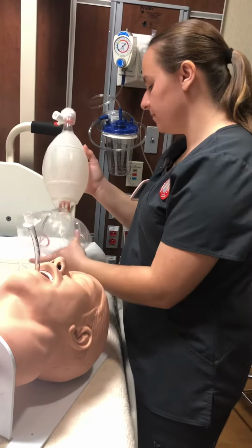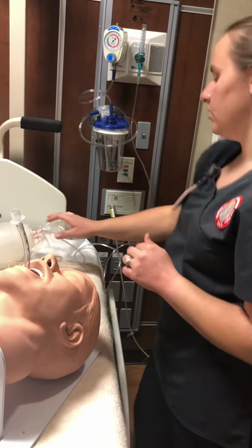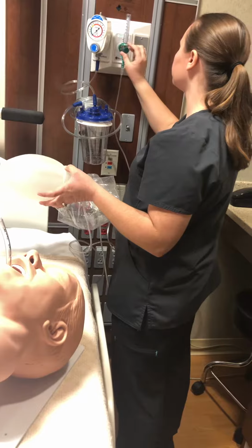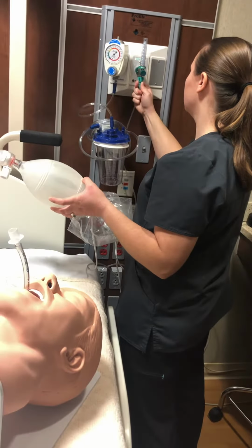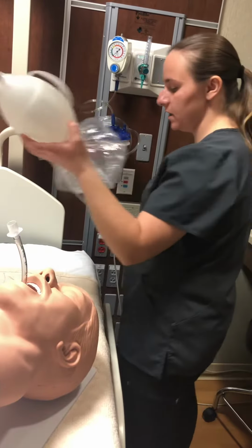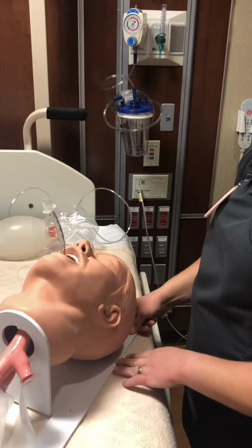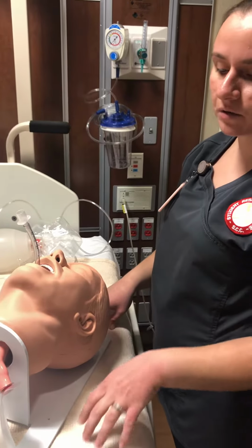When I am done, I need to place the patient back onto their ventilator, and if they need any humidity, then I need to shut this off, remove it from the oxygen source, place it in the proper area, and then I need to reassess the patient to make sure the oxygen is going to both the lungs.